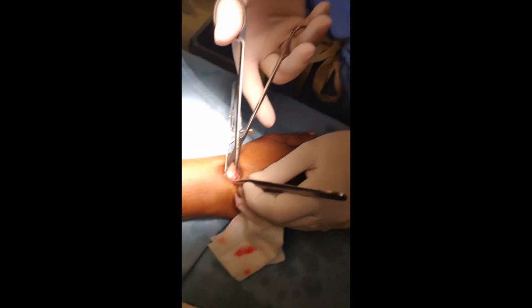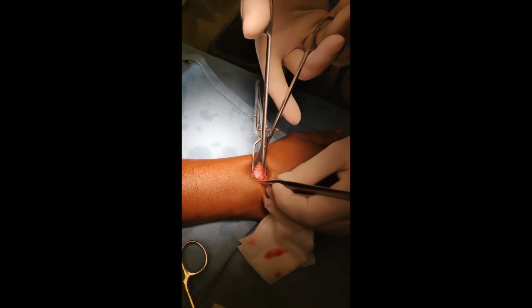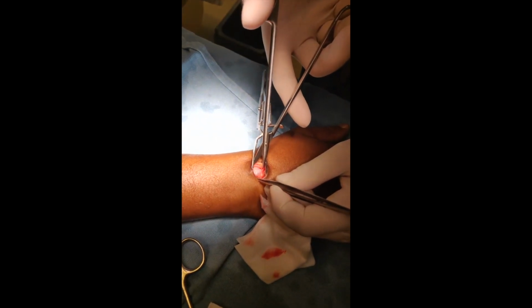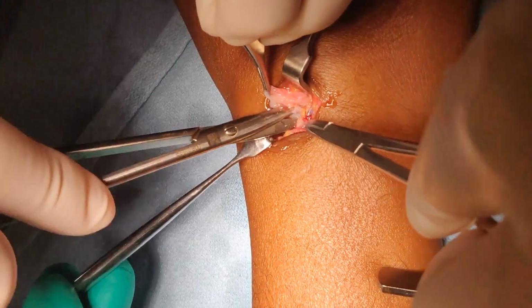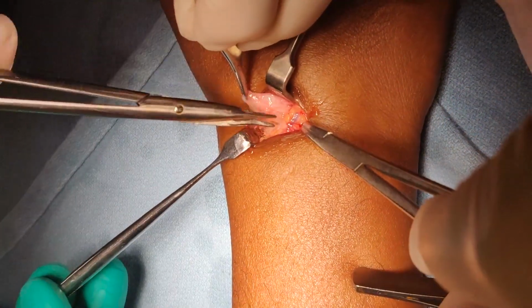In this procedure, a ganglion cyst is removed. A ganglion cyst forms over a joint or tissue. However, the exact cause is unknown. The most common location where they form is on the back of the hand at the wrist joint, such as in this video. Ganglion cysts can also form on the front of the wrist and in the finger joints.